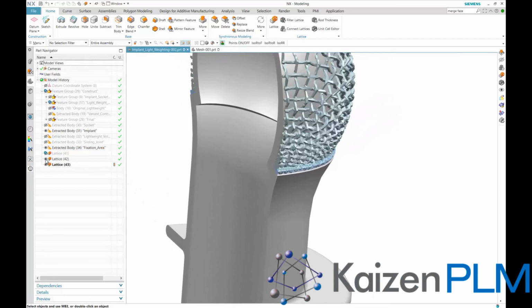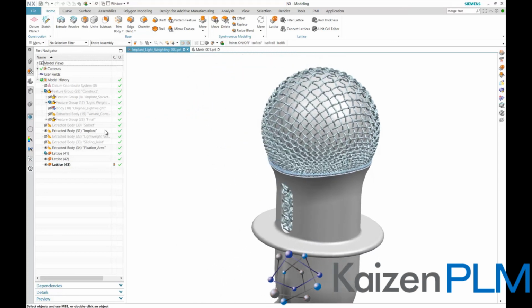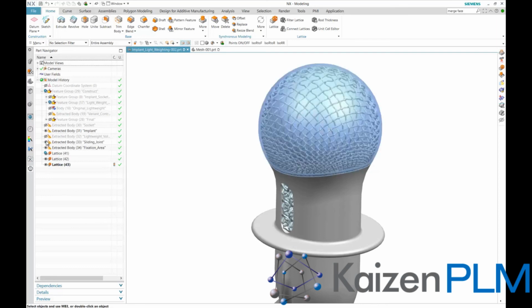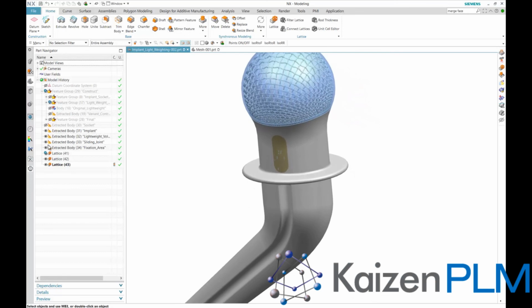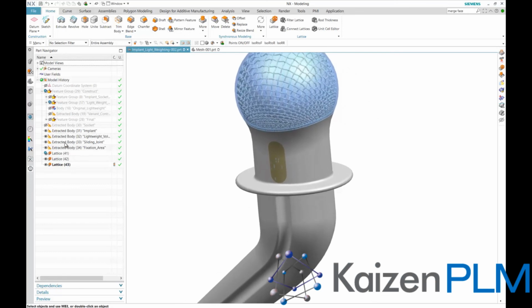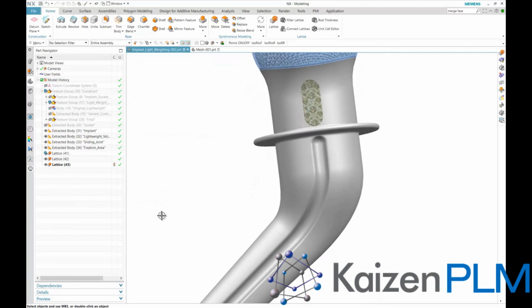With all the lattices required created, we tidy the model by showing all the lattices that have been hidden. We also show the polymeric surface fixated by the lattice on the ball, as we might want the empty space within the lattice structure to be filled, preventing human tissue to get inside. We also bring back the fill volume and make it translucent to show the lattice.